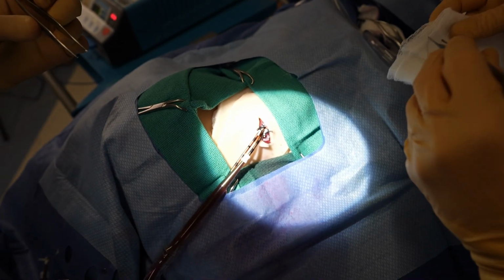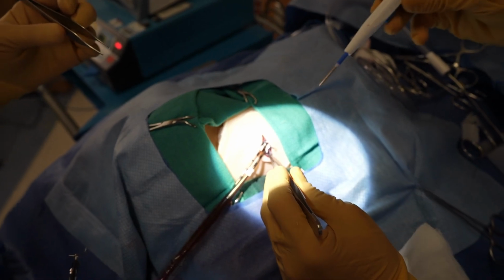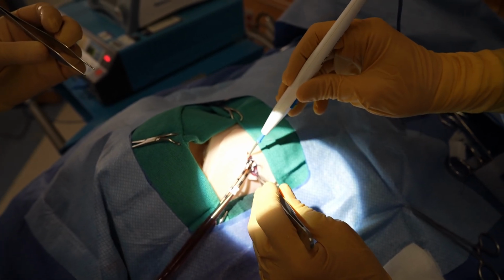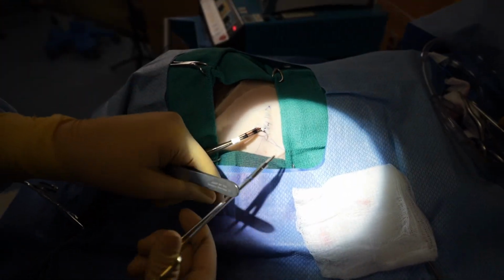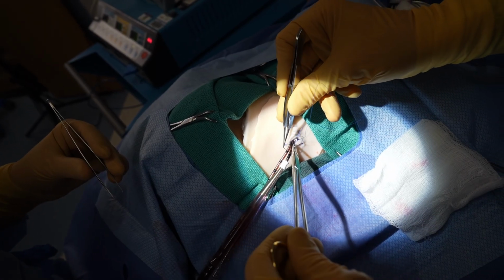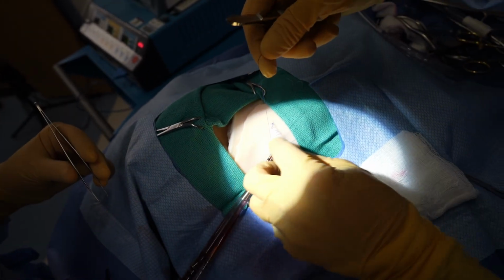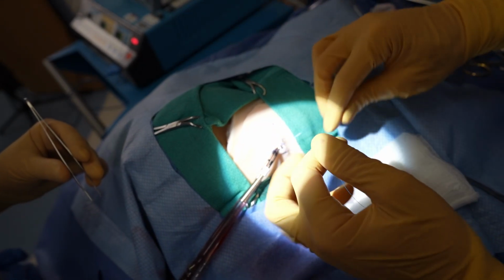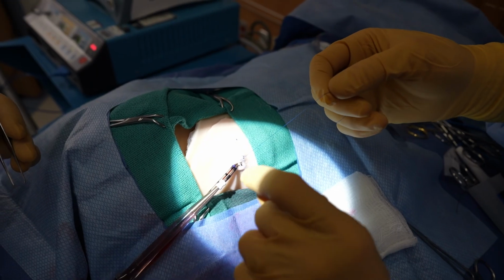After we are on ECMO support, we will attain hemostasis in our neck wound, first by sucking all the blood out of the area and then using electrocautery to take care of any bleeding at the muscle level. We use a Prolene suture to close the incision, and then we secure each of our cannulae to the patient's skin using 3 sutures. These sutures can be braided sutures such as silk or monofilament sutures such as Prolene.